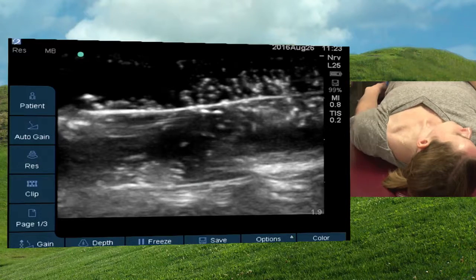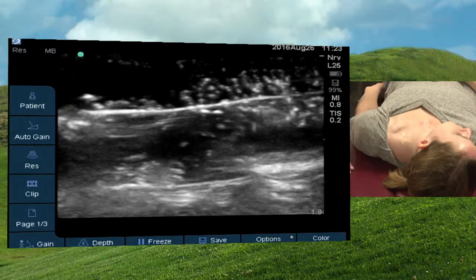The point is, it's very easy to cannulate the internal carotid when you're using a long axis view with a central line. It's happened to me. It's happened, I think, to everybody who does central lines. And it'll happen to you if you do central lines.